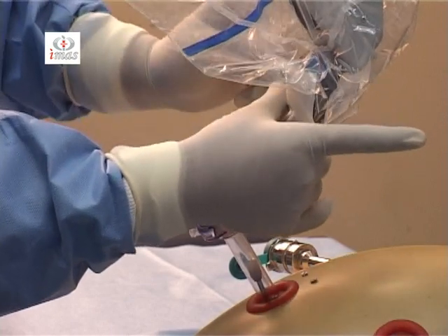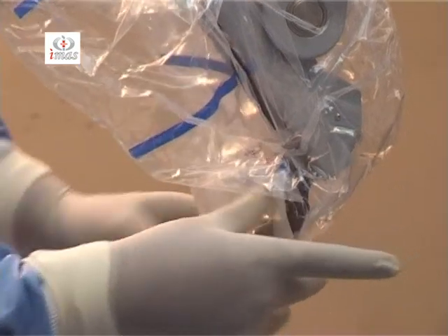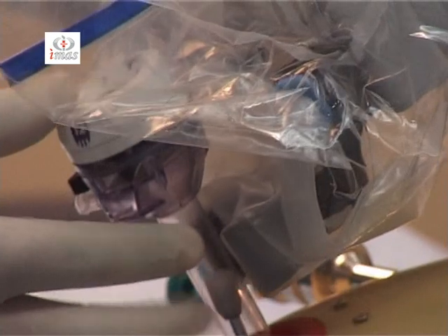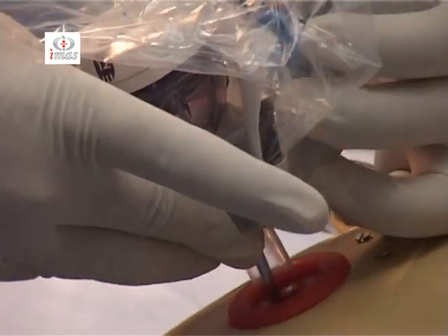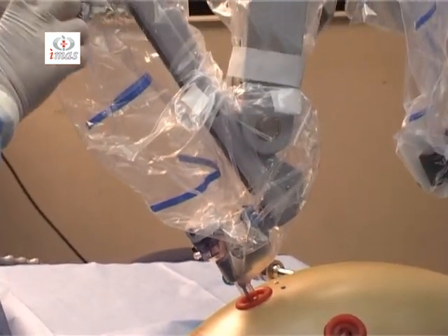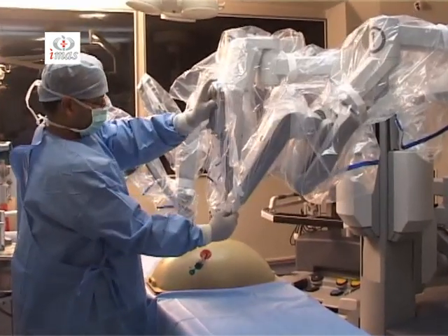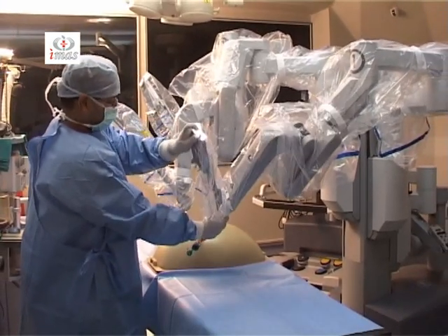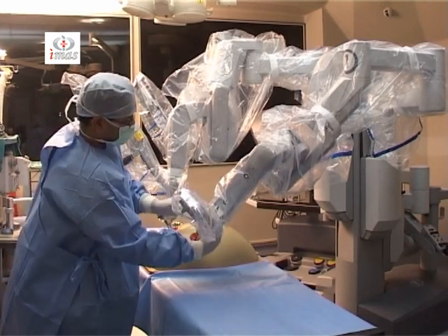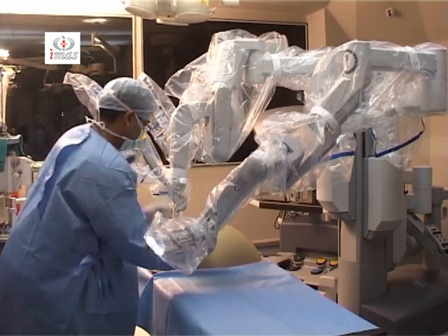Draping it right is very important, otherwise this drape can itself obstruct proper docking of the system. So now it is docked. R1, I made the arm parallel to the port by using the port clutch button.